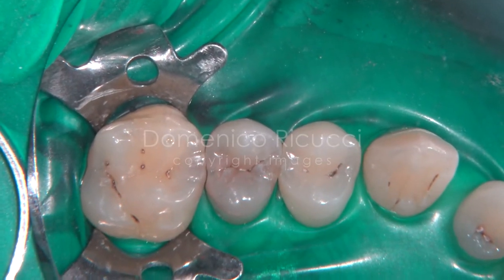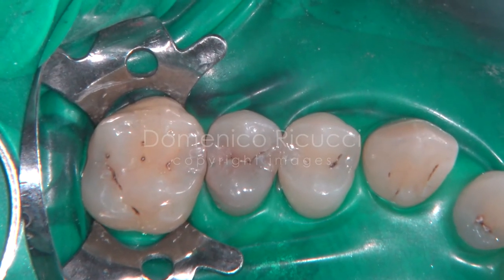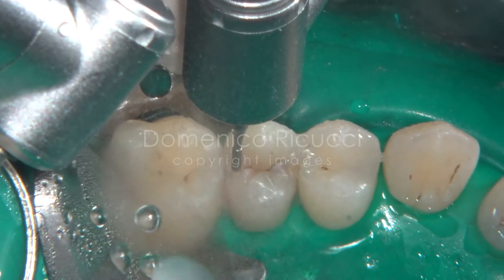Anesthesia is administered and the quadrant isolated with rubber dam. Note that the occlusal surface is intact. The distal lesion is accessed with a high-speed small bur.